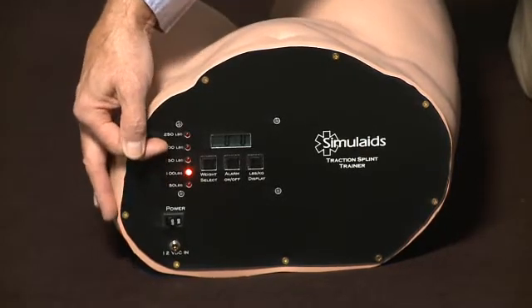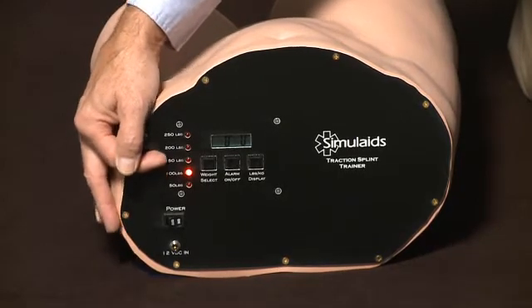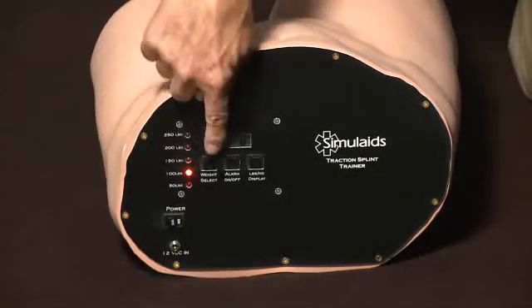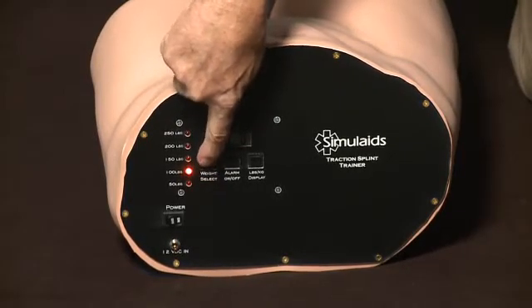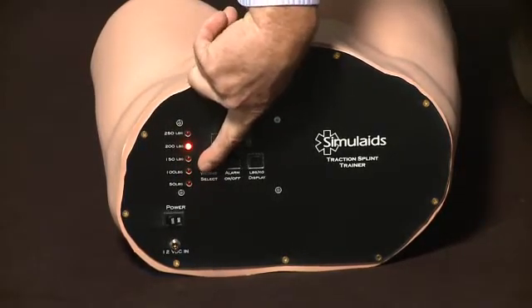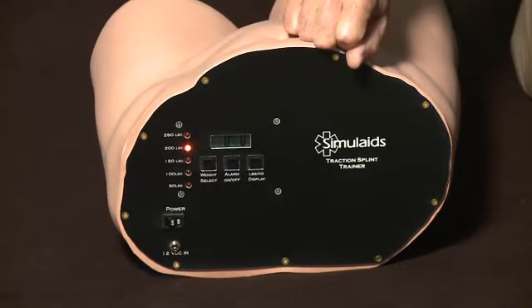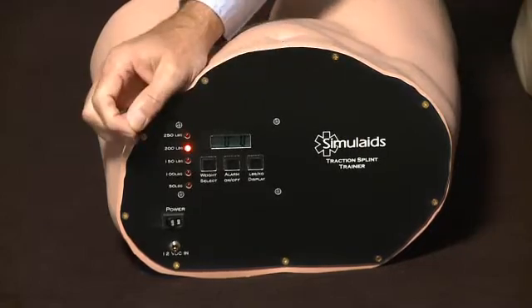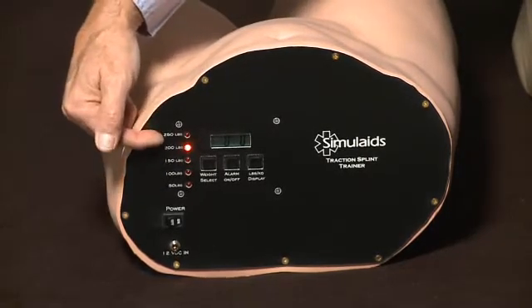If you care to change the pound setting to test or teach the student a different weight class setting, hit the select weight and the light will go to the unit selected. Wait a few seconds and the interior machinery will adjust to the 200 pound setting.